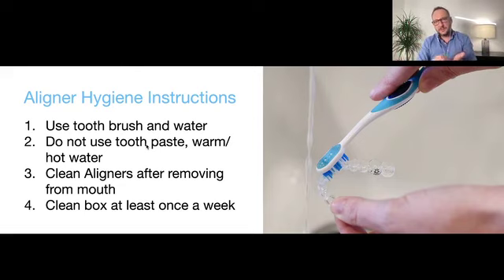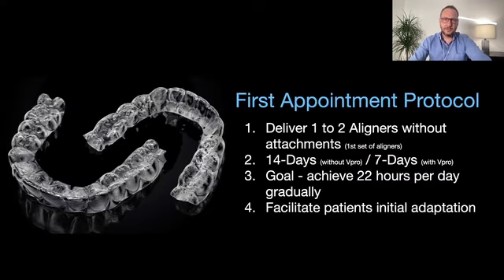And they are going to risk creating marks in the plastic, and it's going to retain more bacteria and be less aesthetic, okay? And also do not use warm or hot water, because a patient of mine already did this. I think he was cleaning better, but it deformed all the plastic, okay? I always remind them, as soon as they remove the aligner from the mouth, to at least use water, ideally with the toothbrush too, and also clean the box, because the box with the moisture and everything else is in a very bad condition after 1 week, okay?